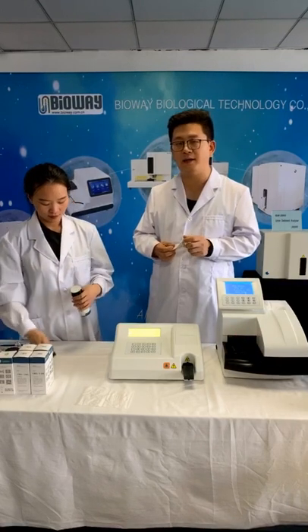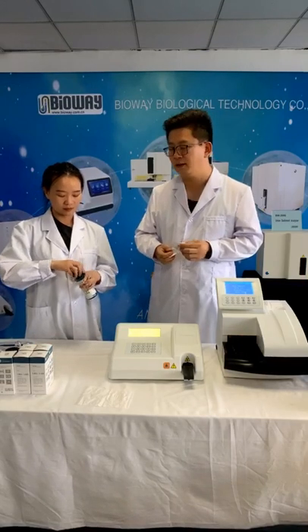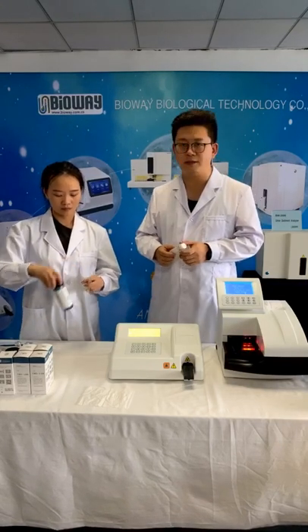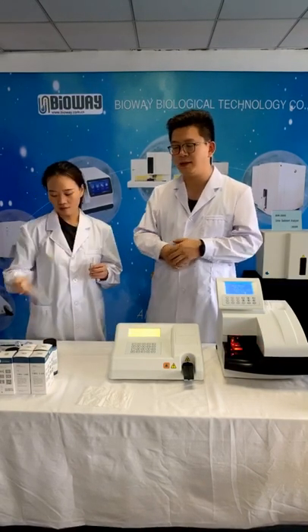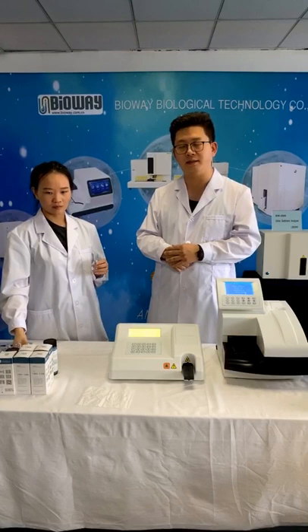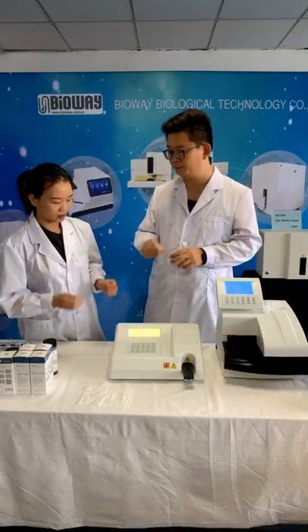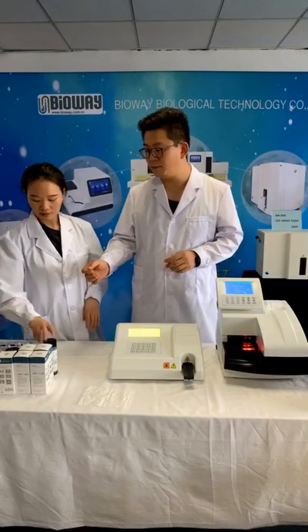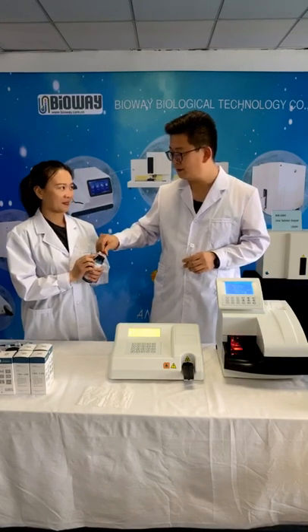BW200 has two test modes. One is single, the second is continuous. So if you have multiple tests to conduct, I suggest you use the continuous test mode. That will save some time. But this time, for the regular test, I will present the single test mode. It's a single test mode.